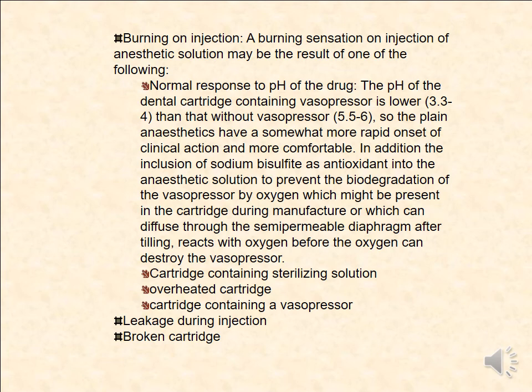Leakage during injection, which leads to damage to the diaphragm so that the local anesthetic solution goes outside. Broken cartridge: if there is high pressure on the cartridge, this leads to a broken cartridge.